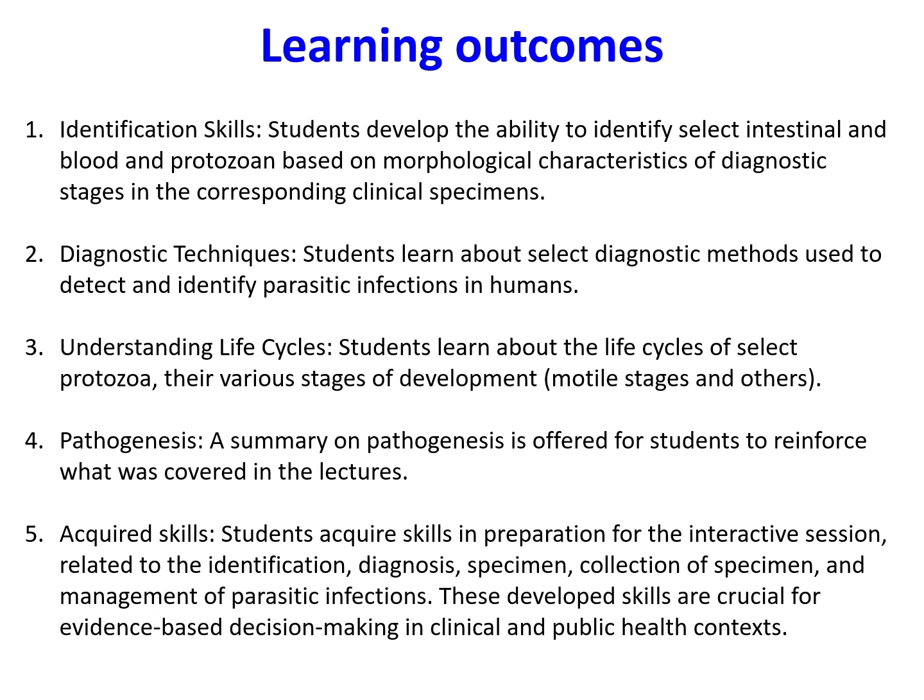infections in humans. Going very briefly over the life cycles, the students will refresh their memories on the life cycles of these select protozoa and their various stages, motile and non-motile ones, which helps them get an idea about the pathogenesis, the sites of infection, and that will of course reinforce what was covered in the lectures.